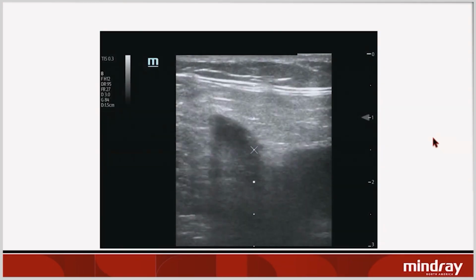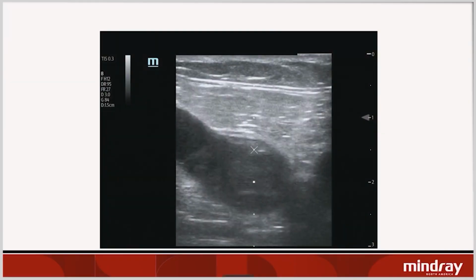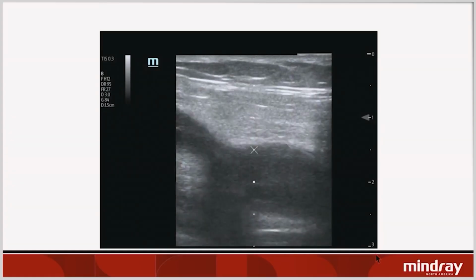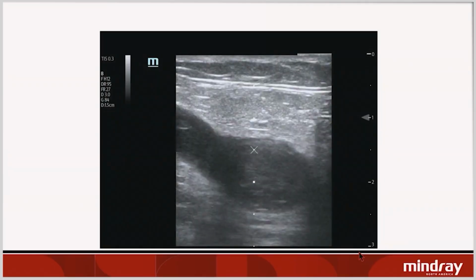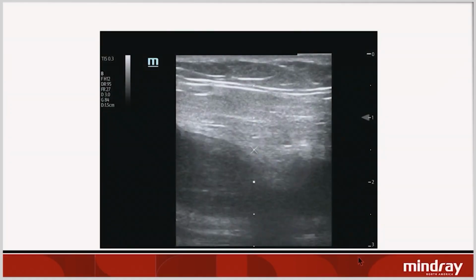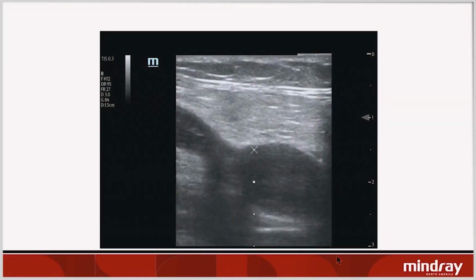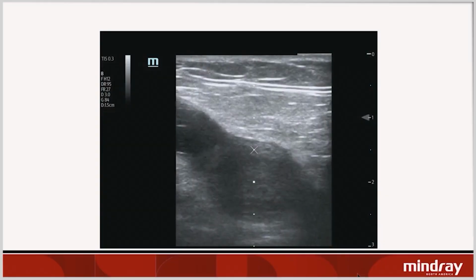And this is something that's not done often enough. If you see a clot, or you think you have a patient who may have a PE, or it's even on the differential, go look at the legs. It's a much easier exam than a cardiac exam, and if you find a clot in the leg, a DVT, and the patient came in with acute dyspnea, I think you've just narrowed your differential pretty nicely, and you're going to have a much higher suspicion at that point for working up PE.